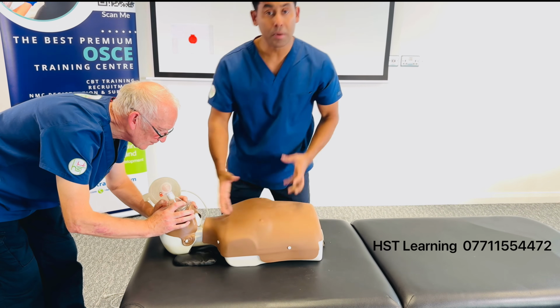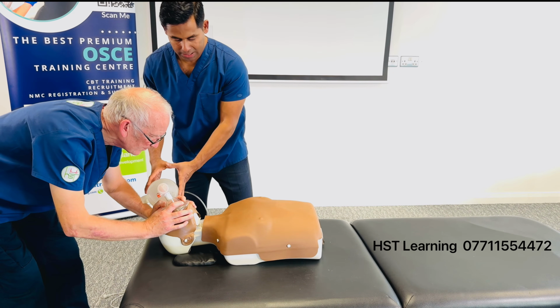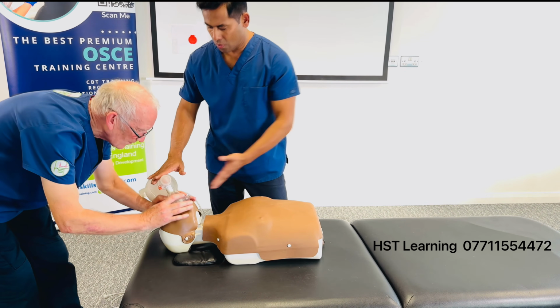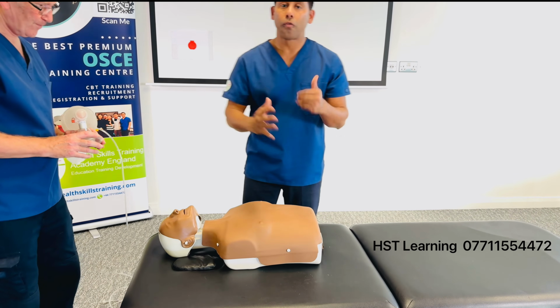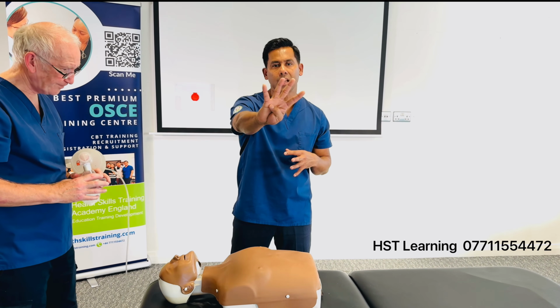Okay, those are the common errors you can see in terms of rate, rhythm, and giving the ventilation. Now, you need to carry on compression. That is fine. Thank you. So you need to compress the chest for 2 minutes. Ideally, this will take about 4 cycles.